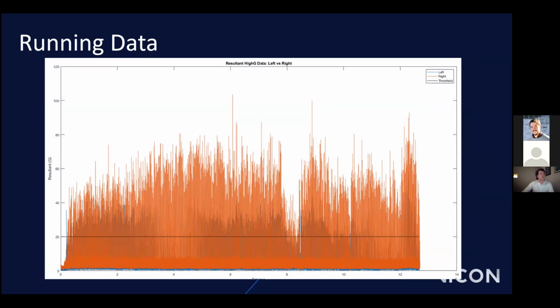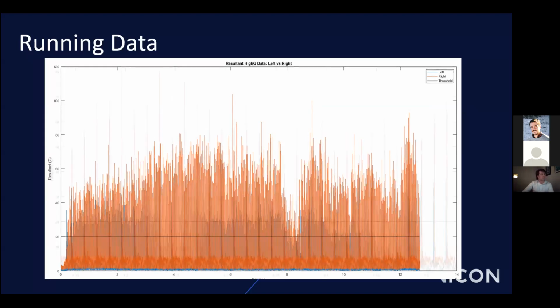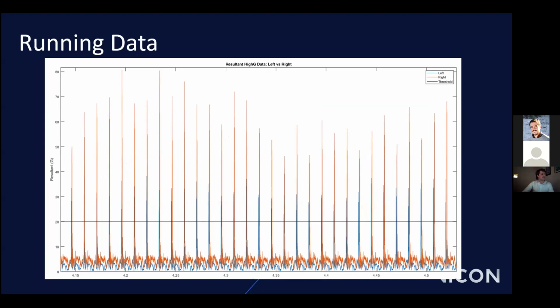So I've plotted the left and right together, but as you can see, the left leg, which is plotted in blue, is quite well hidden by the right leg data. So I've zoomed in there to make it a little bit more clear, and hopefully now you're starting to see the right leg is clearly showing some much higher impacts than the left leg.